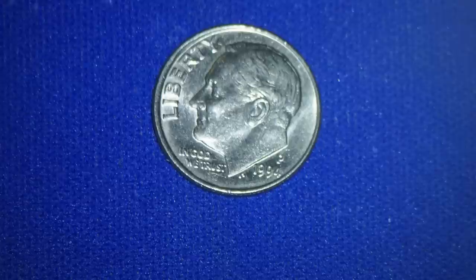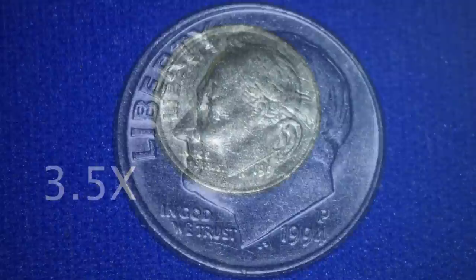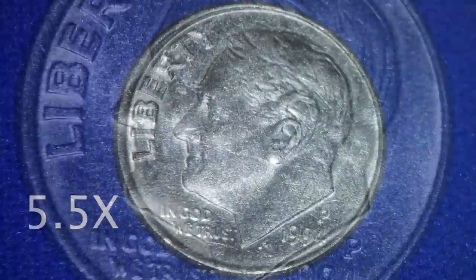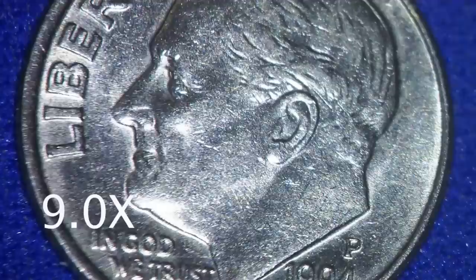I actually don't start using the microscope except at 5.5x. Here's an image of the dime at 5.5x through the microscope. When I'm doing most of my work, I'm rotating up to 9x. At 9x, you can see that accuracy becomes much more attainable.